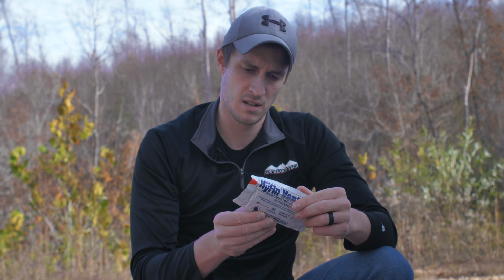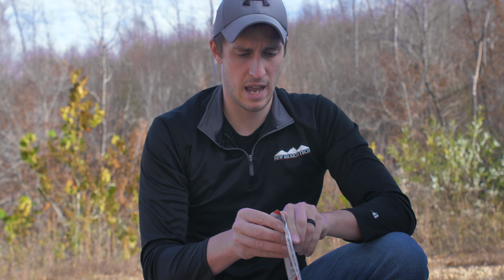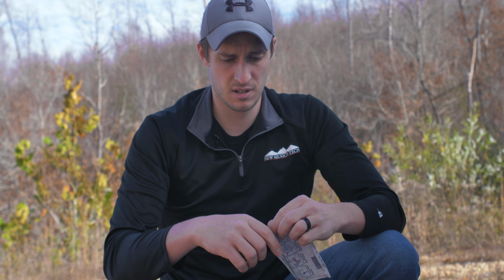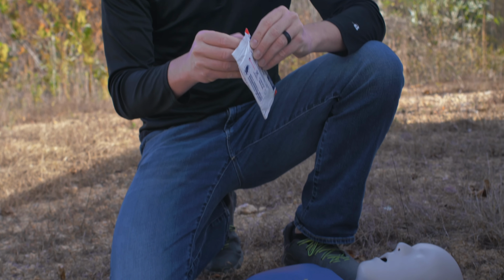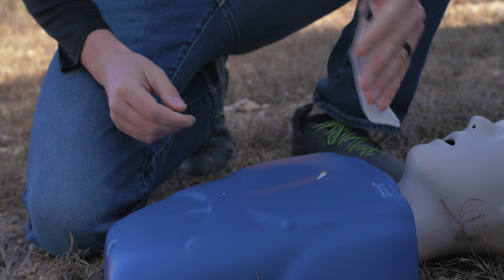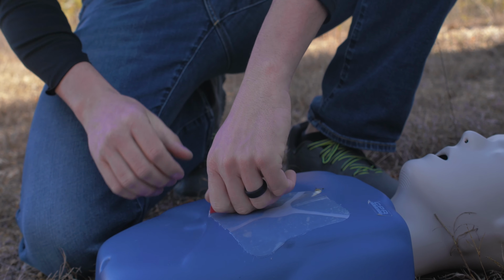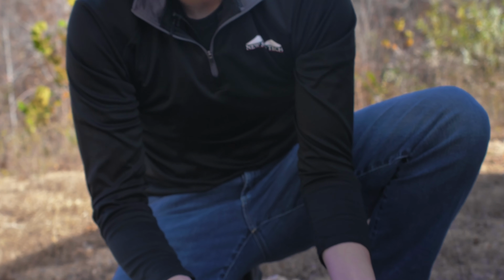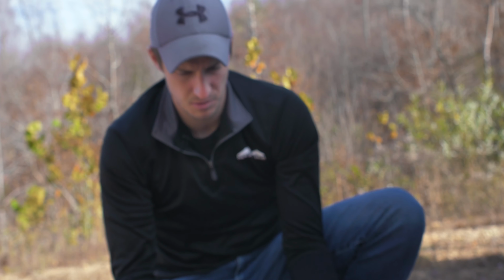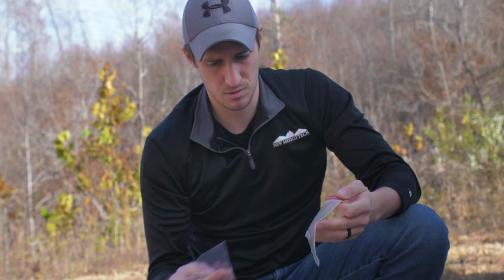So here, I've got one from December 9, 2020. This is one that was in my backup ankle kit, and it sat in the car for some of this past summer, but it's kind of been all over the place. Peel it off, stick it on, nice and sticky. Just like the other one that was 2 years old, it pulled off, didn't leave any residue, didn't seem quite as sticky as some of the previous ones, but I think it would do the trick just fine.